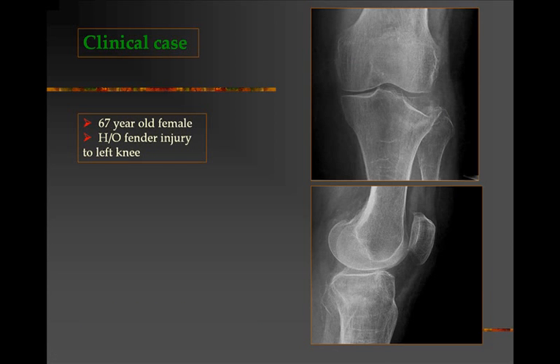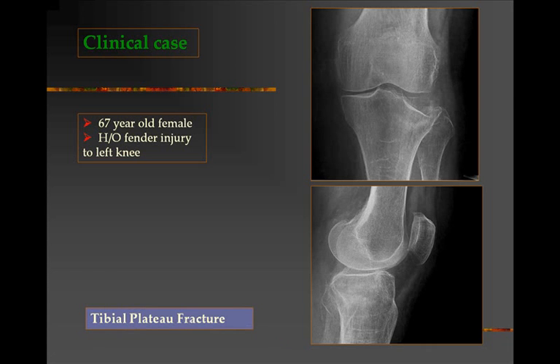Here is another clinical case of a 67-year-old female patient who sustained a fender injury to her left knee. Note that the bones are osteoporotic and the lateral condyle of the tibia has been crushed — there is a fracture. This is called a tibial plateau fracture.